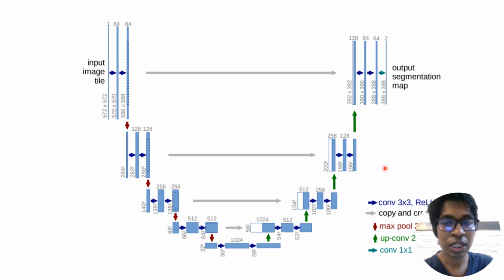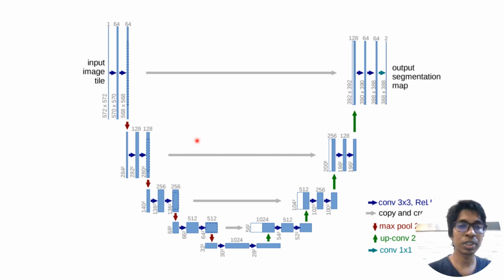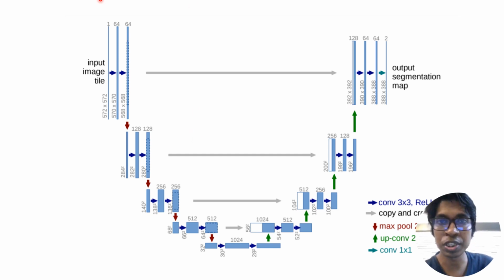In the left side there are four blocks for the encoder, and in the right side there are four blocks for the decoder, between the input and output. The most important feature is that it extracts features through multiple convolutional layers and decodes through transpose convolutional layers.